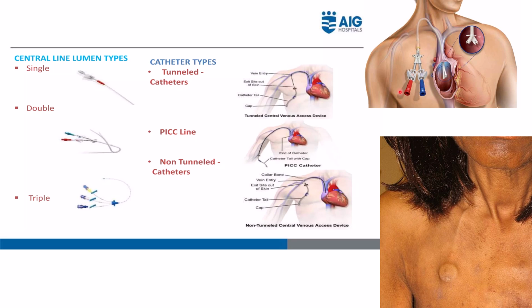The red lumen is used for drawing blood from the body to the dialysis machine, and the blue lumen is used for returning the blood from the dialysis machine to the body. The common sites are the femoral vein, internal jugular vein, and subclavian vein. But in a dialysis catheter, the subclavian vein is not used because it can cause stenosis. That's the difference between a dialysis catheter and usual catheters.